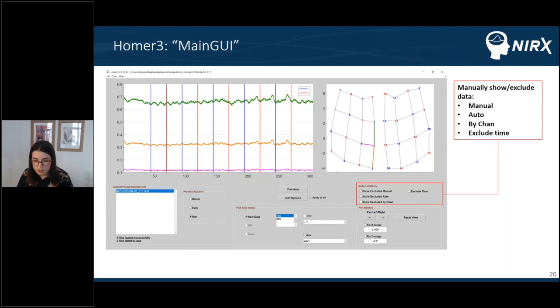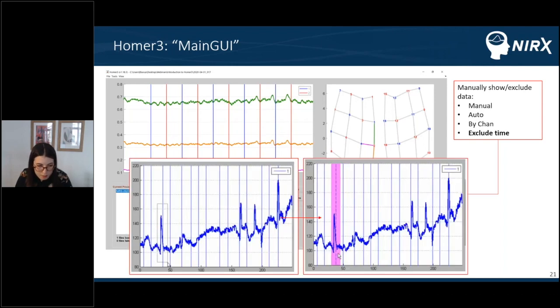This can be done just by visually examining the raw signal in the data window. So here we have an example. This is a whole other data set because it had bad quality, so you can easily see the spikes.